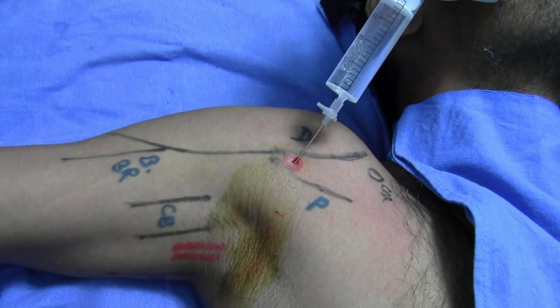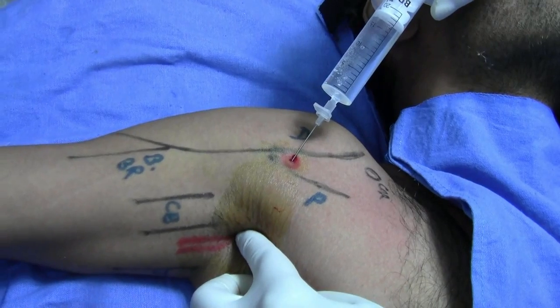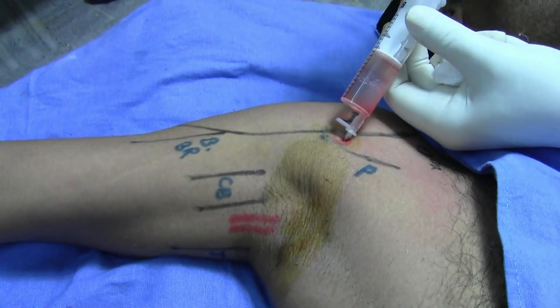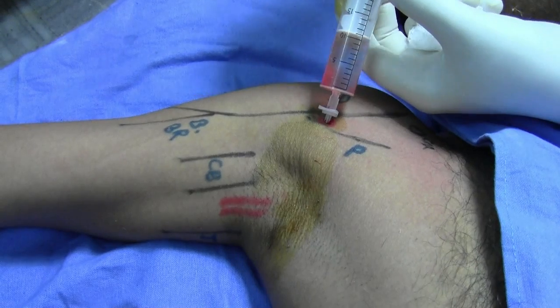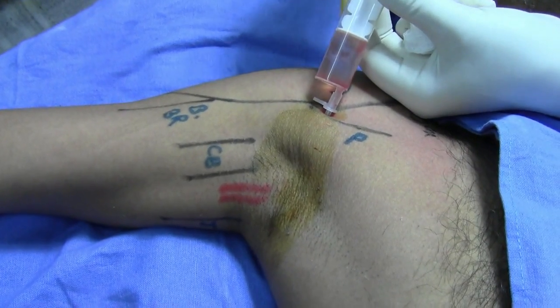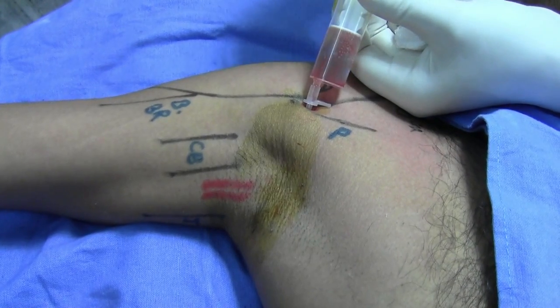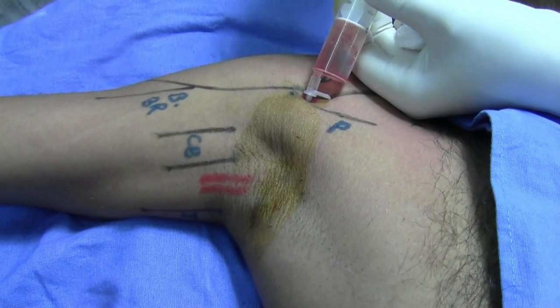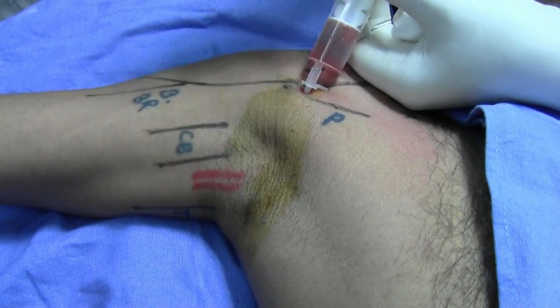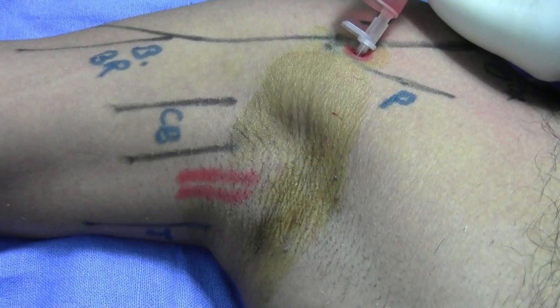After aspiration, inject a small amount of local anesthetic solution and withdraw the needle slightly — there should not be any resistance during injection. I have further advanced the needle; blood is present, so withdraw and go a little beyond. Blood is still there. Now there is no blood, and the ballooning of the sheath is occurring. Rotate and check again — there should not be any blood.